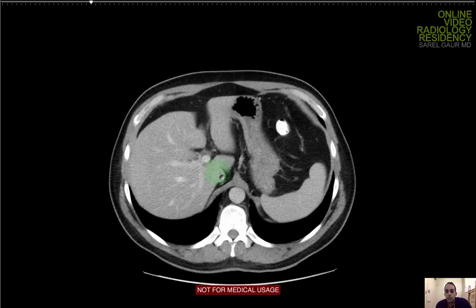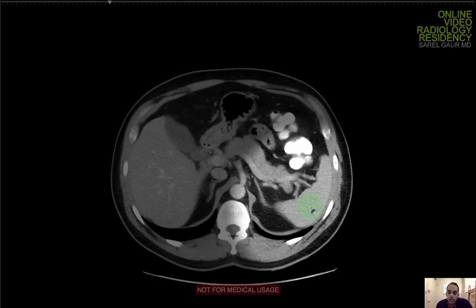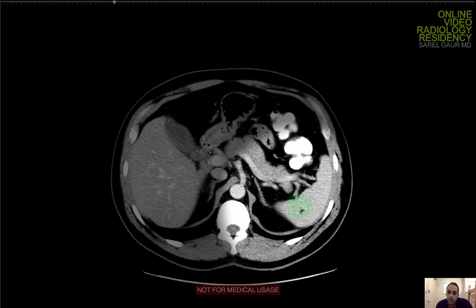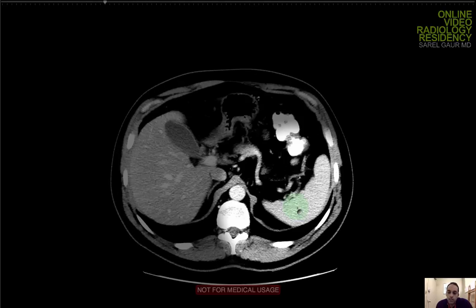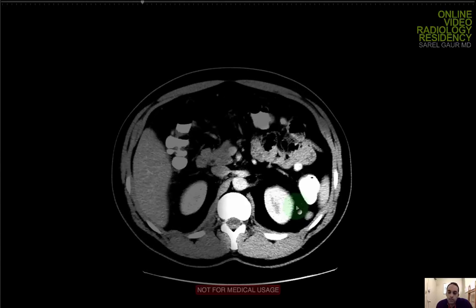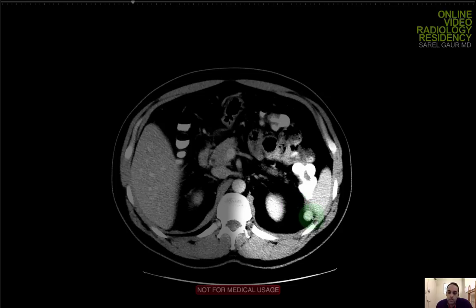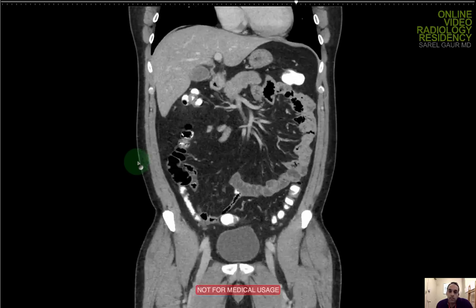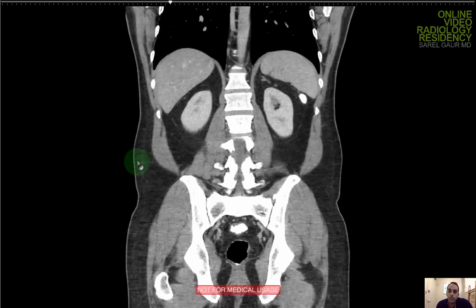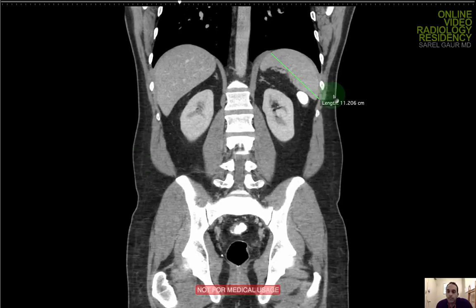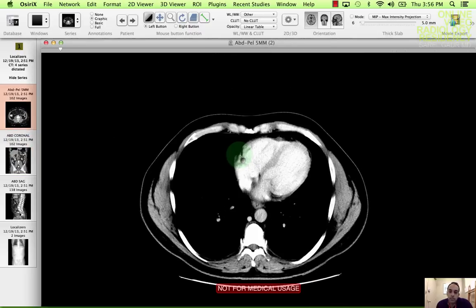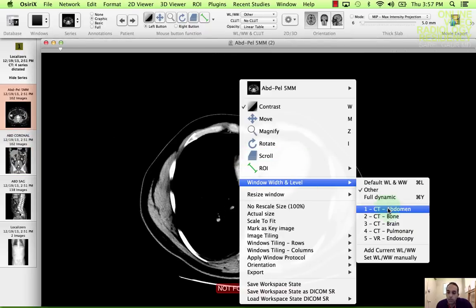Next on the checklist is the spleen. I'm looking for focal lesions and size. I'm going to narrow the windows to increase sensitivity. I'm seeing a small normal finding here — a splenule in the splenic hilum. Getting a measurement on the spleen: 11 centimeters — normal. So there's no evidence of splenomegaly and no focal splenic lesions.